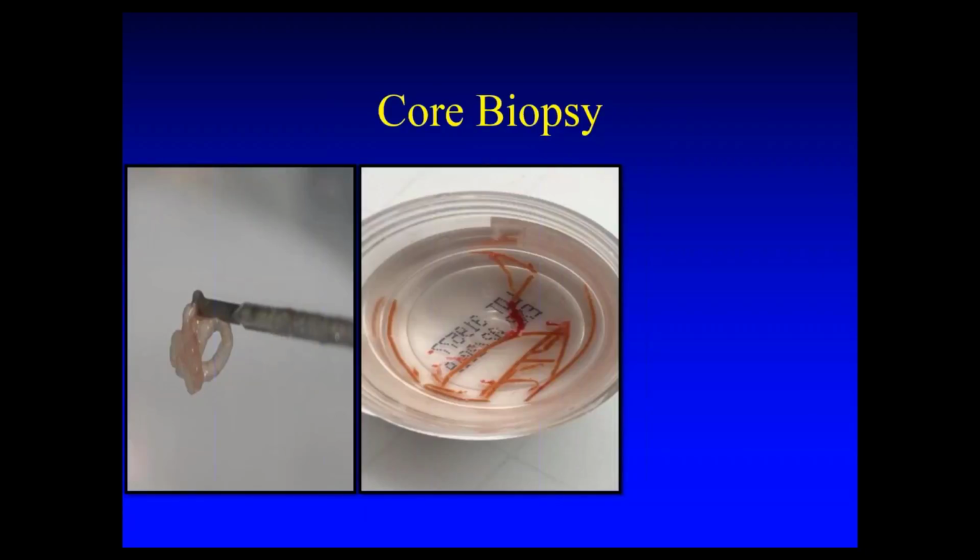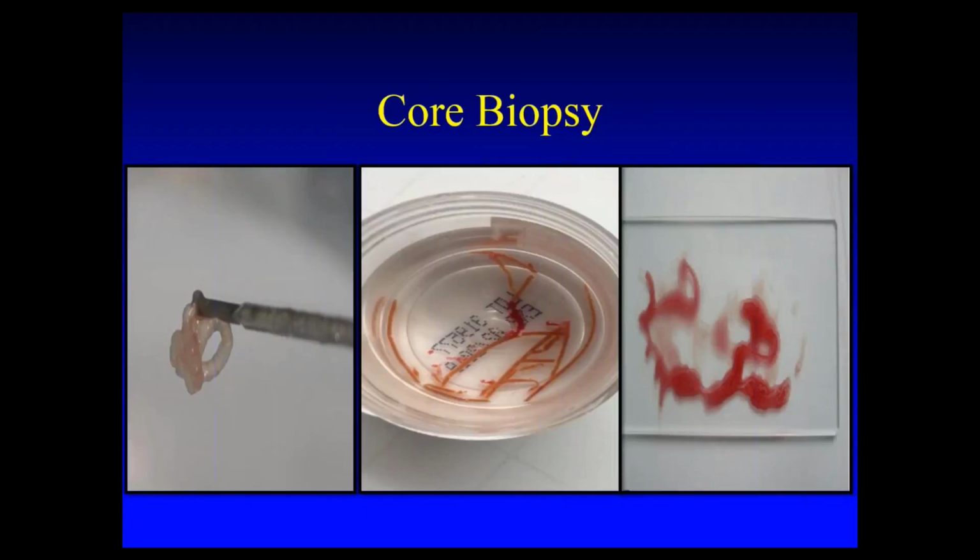Here, I just want to show you the red is not the core. The red is actually blood, but it's the white film over the red that is the core. Here you can see that the white film over the red is the core. The red is the blood.